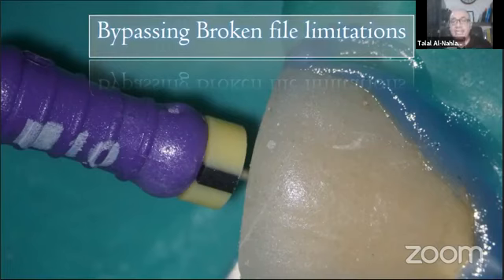So in cases indicated for removal, where I can see the file and I can vibrate it, I have to go for removal rather than bypass. You will tell me why. You go for bypass because bypass is safer and will preserve more tooth structure. I will give you some ideas, and we will discuss this later.